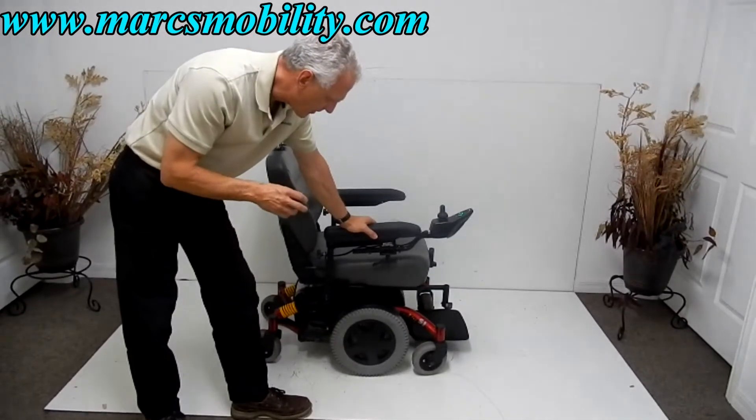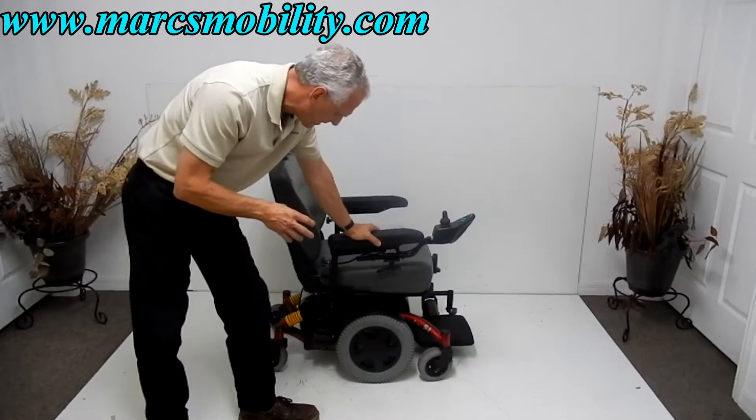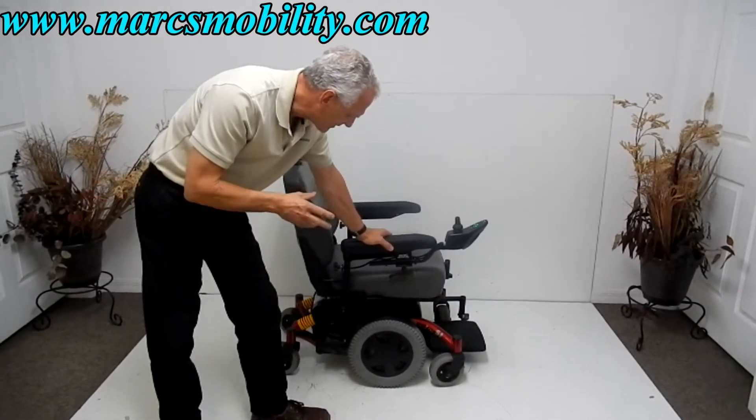This is an Invacare TDX-SI power chair. This power chair has six wheels on the ground and it's in excellent condition.